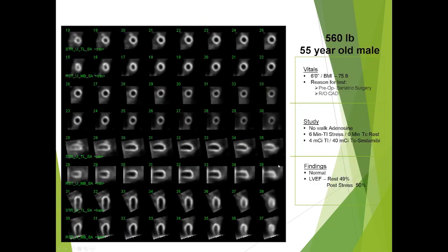One of the advantages is that this is a patient who weighed 560 pounds.